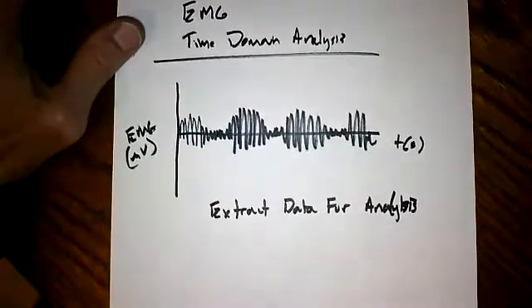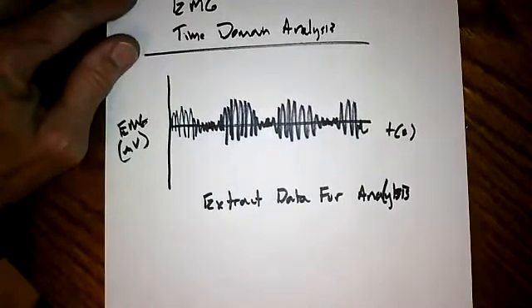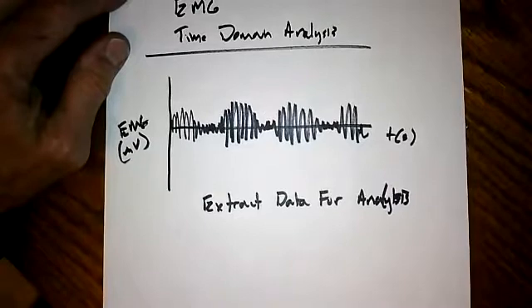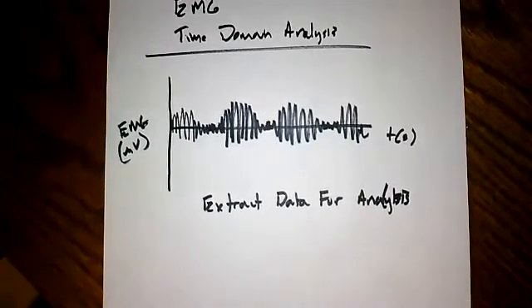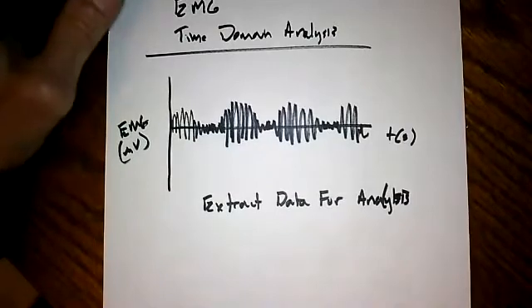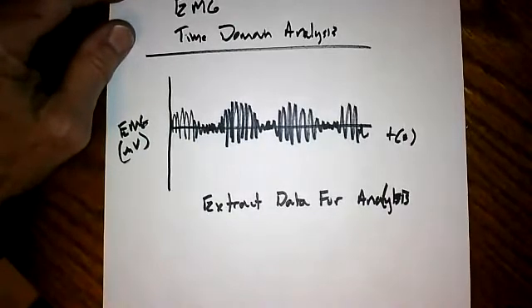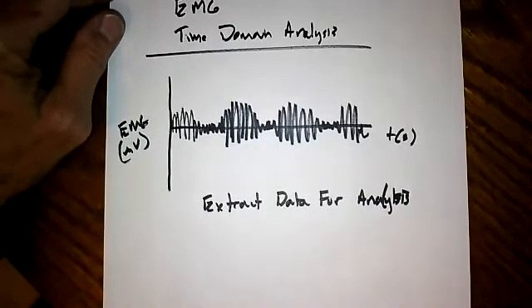What is nice is if there is some kinematic marker that goes along with this EMG data set. That kinematic marker may be some position data, maybe from an elgon, or maybe acceleration from an accelerometer, and the Cometa system has accelerometers. You have to remember how to interpret acceleration in order to pull out the correct phases of data. There are other ways to do this, and I'll explain some alternative approaches later.